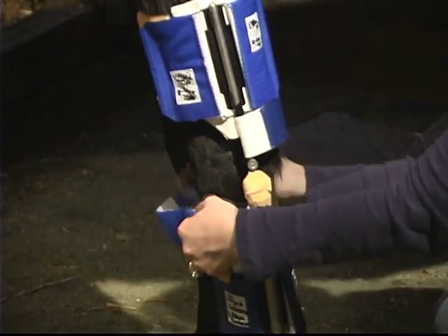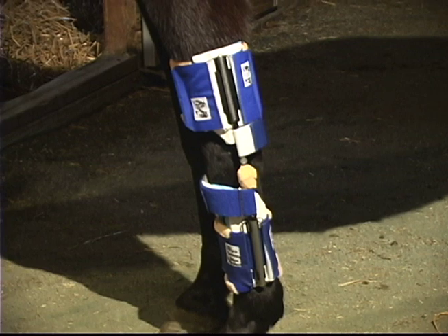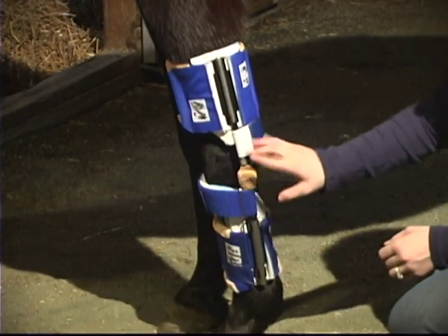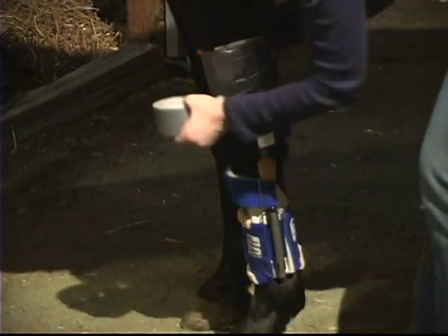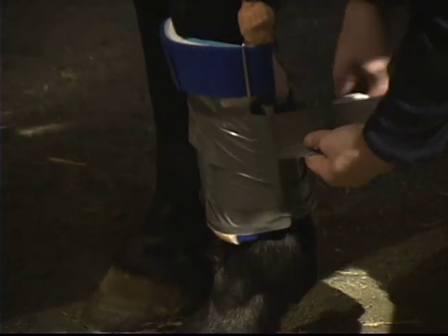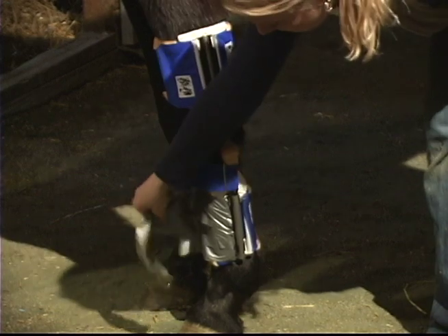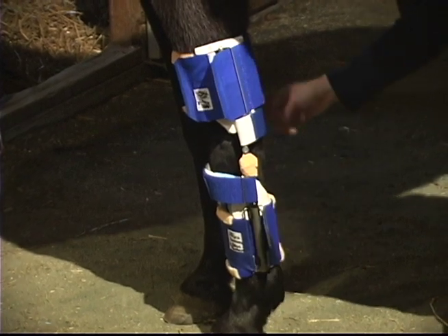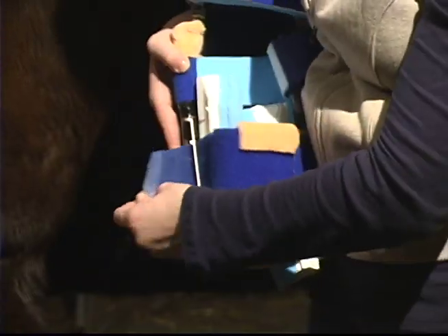Please note, if you are splinting both the right and left leg, when you flip the splint to the opposite leg, the counterforce straps will not be in the same location. The important key is that one strap is placed in front of the leg while the other is placed behind, and one strap should lie above the cam while the other lies below the cam. Wrap duct tape around the top and bottom cuffs to prevent the splint from slipping and discourage chewing. To remove the splint, cut the duct tape, making sure not to cut any straps or cuffs. Then undo the left back top, left back bottom cuffs, and both counterforce straps. Once removed, fasten all Velcro straps to maintain proper orientation.